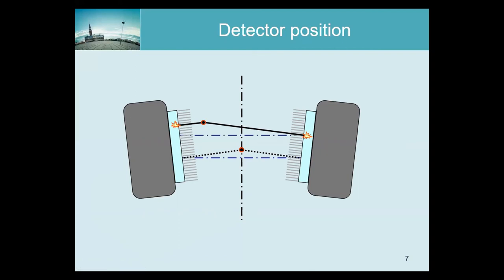So some gamma cameras are really dedicated to SPECT. And if they do that, they tend to fix them in a position, making sure that when you do a SPECT scan, the detector is nicely parallel to the rotation axis. But other gamma cameras are designed for flexibility, because you want to do planar imaging with it, you want to scan legs, feet, and all that. And those cameras are extremely flexible, and the drawback of all that flexibility is that maybe they don't return exactly to the position that you want for SPECT.